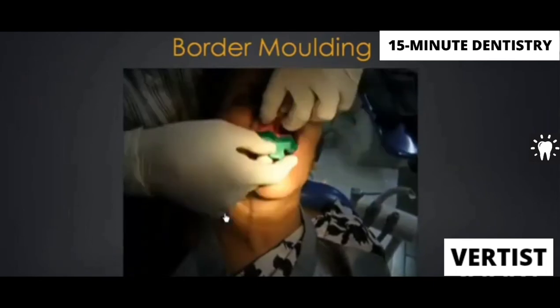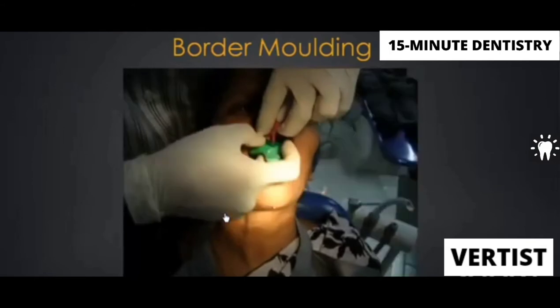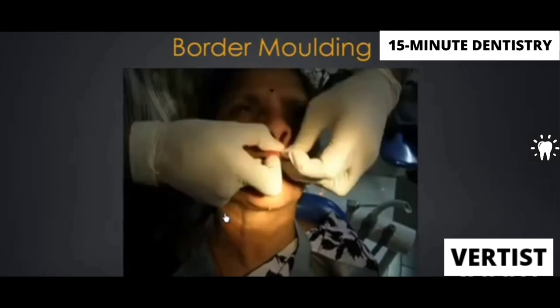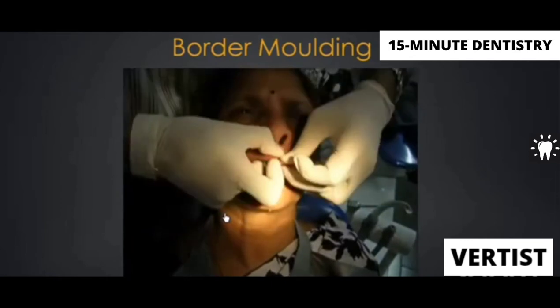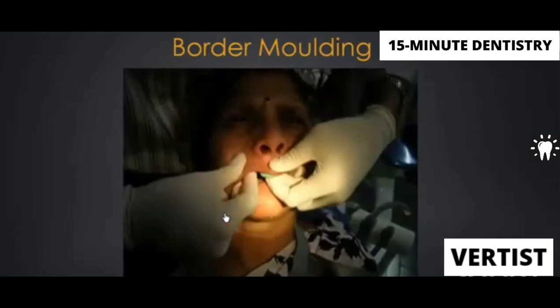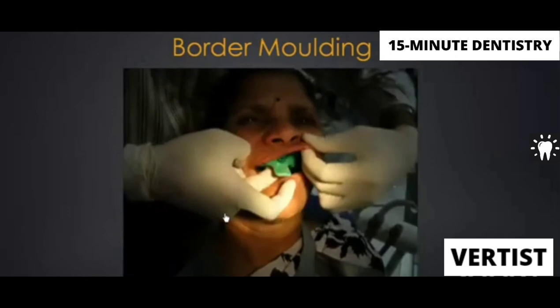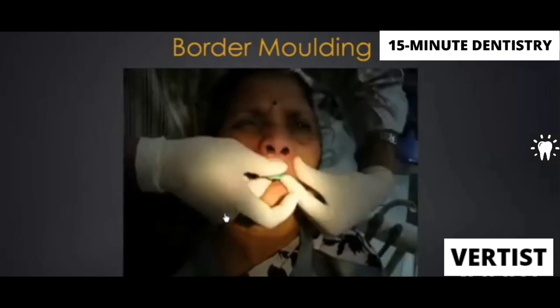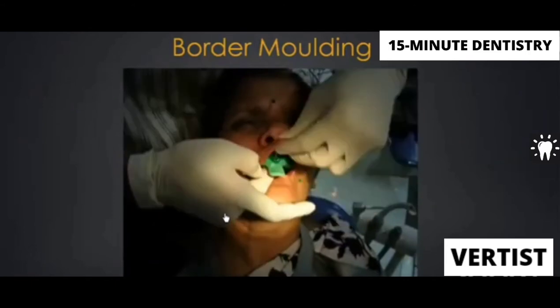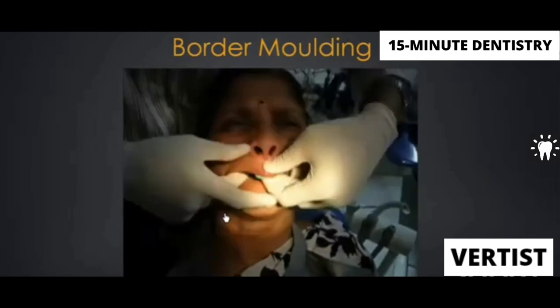Please temper. The second advantage of tempering the material is that the heat dissipates evenly and you can mold it much better. Once you place it in the patient's mouth, just push the material and start the molding. We know what the molding steps are. For the labial frenum, we tend to pull the lip outside, upward, outside and down. For the labial frenum, we don't do any side-to-side movements, because there are no muscle attachments in the labial frenum. So again, I'm telling you, for the labial frenum, up, out, down, that is it.